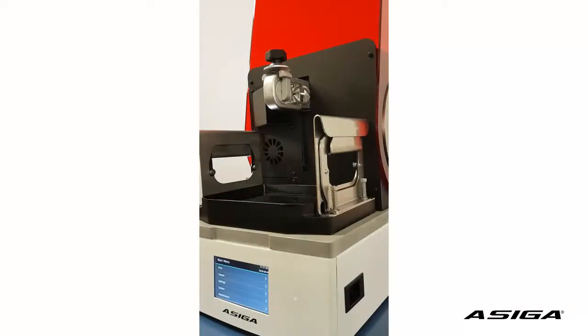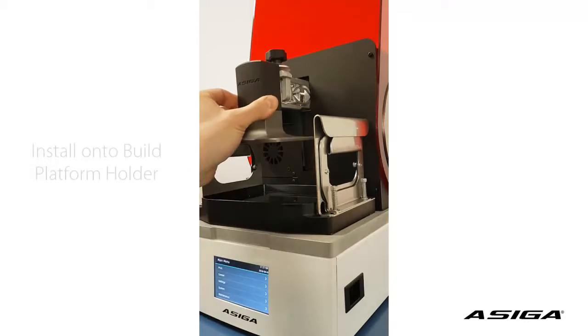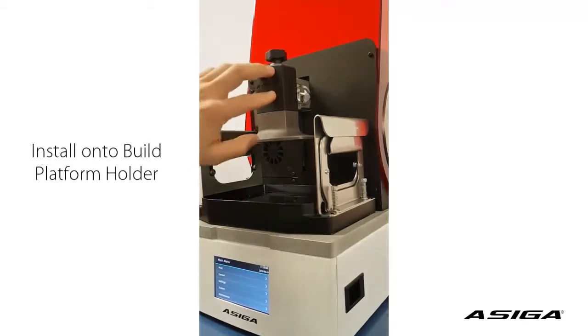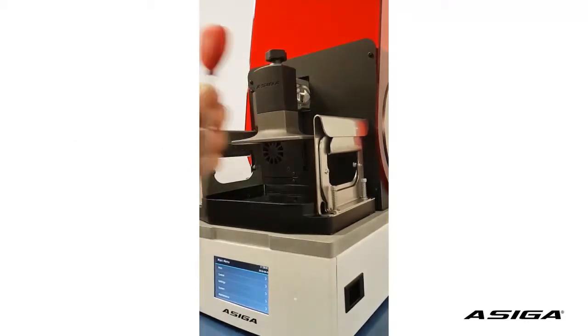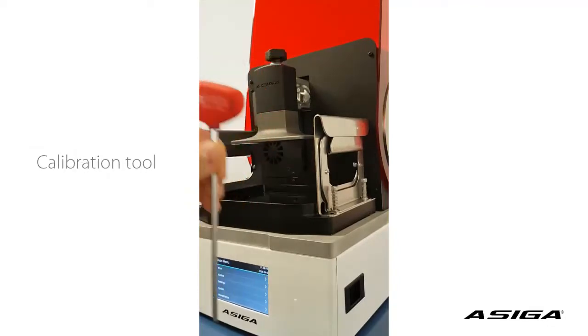In this video, we're going to show you how to set the correct zero position with your new Max Printer. You will need the build platform, which is going to be seated into your platform holder. And you will need the hex screwdriver 4 mm with the balloon head.